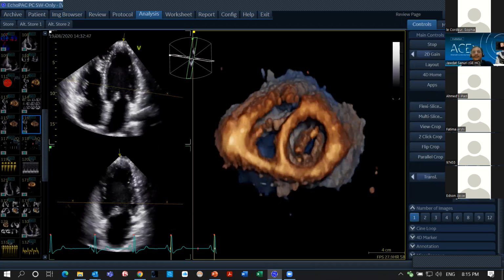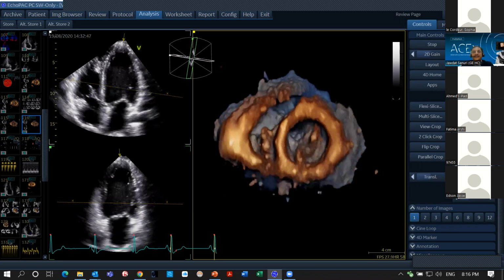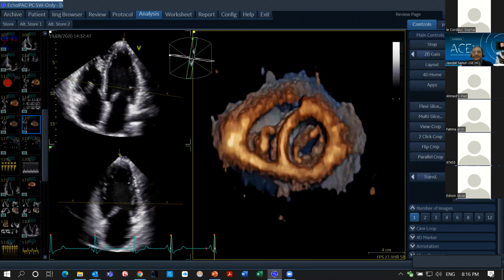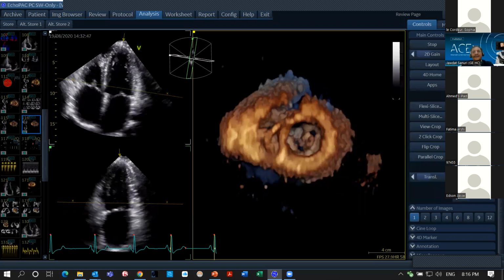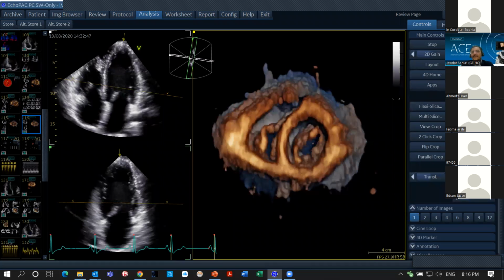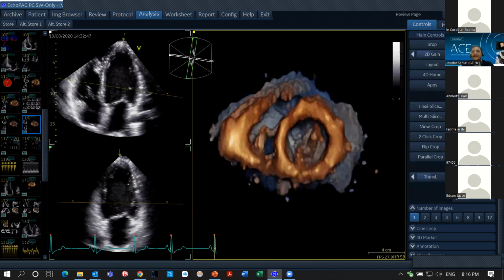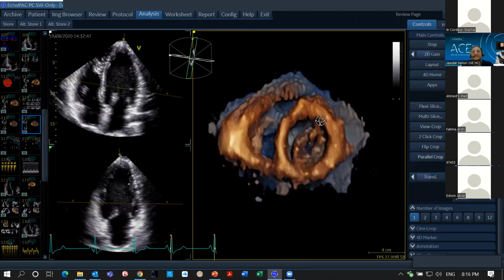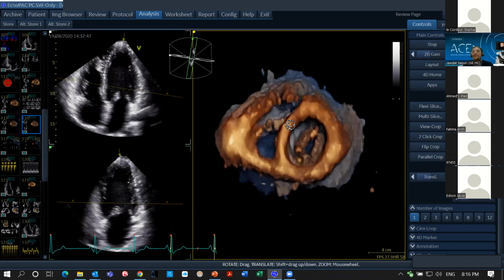It's a very good question. To be honest, I'm not sure if I can answer it. I think it's one of our application team. Is any of the application team here who can maybe clarify what it's doing? I think it's a smoothing of the 4D. It's a speckle smoothing of the 4D. So when 4D clarity is maximum, you can see the 4D is more smooth and homogeneous.